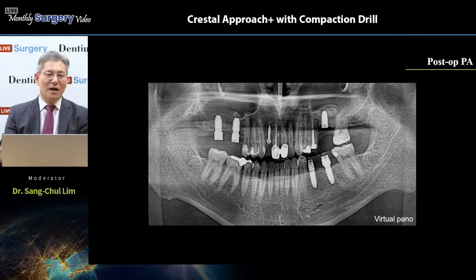Always even size and even power is given to the sinus floor, very nice, well done, and looks like the lateral approach style, dome shape elevation of the sinus membrane. Also, many of the bone forming cells come from the sinus floor and the membrane.